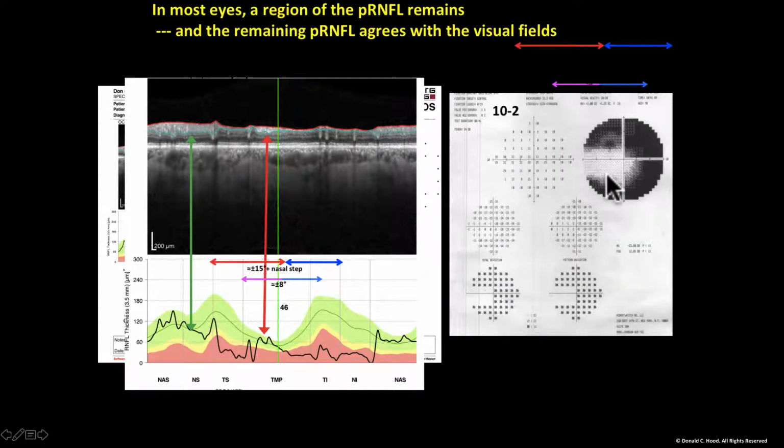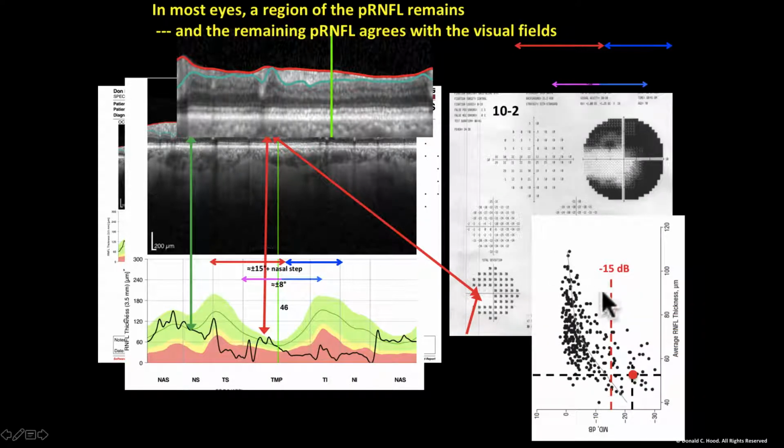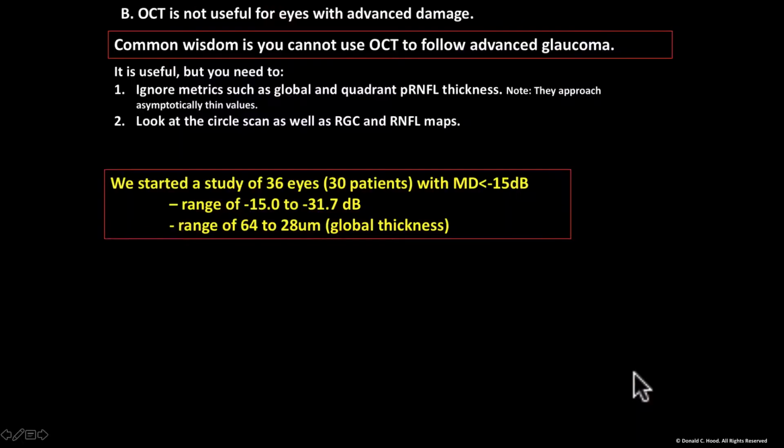You can take a better look at the 10-2. This area here, again, is this area here. That's what you want to preserve. Well, you want to keep that too, of course. All right, let's blow it up. Look at the beautiful picture. You can watch this carefully and see if you're preserving that portion of this patient. And again, this point's over here.